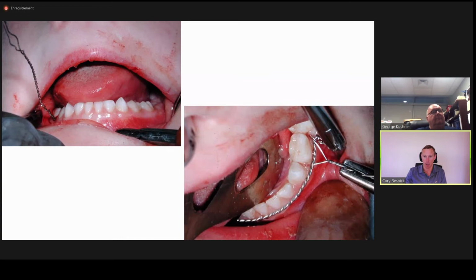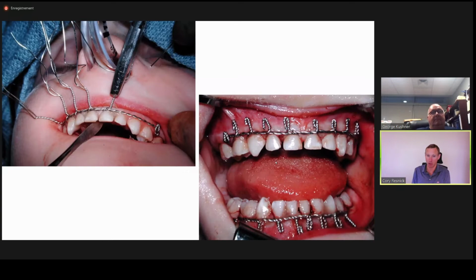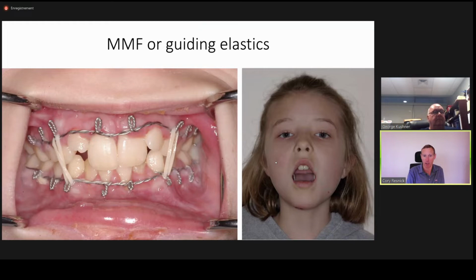And the application after the cable is created and applied to the posterior components of the dentition is really the same as applying the Erich arch bar, except that with the Risdon cable, the circumdental wires also become what are used for the intermaxillary fixation component or the elastic components, rather than having separate lugs on the arch bar as the Erich arch bar does. But the Risdon cable is very versatile, just like the Erich arch bar is, in that it can be used for intermaxillary wire fixation. It can be used for postoperative guiding elastic usage, and certainly a combination of both techniques. So it has that same advantage of versatility as the Erich arch bar does.